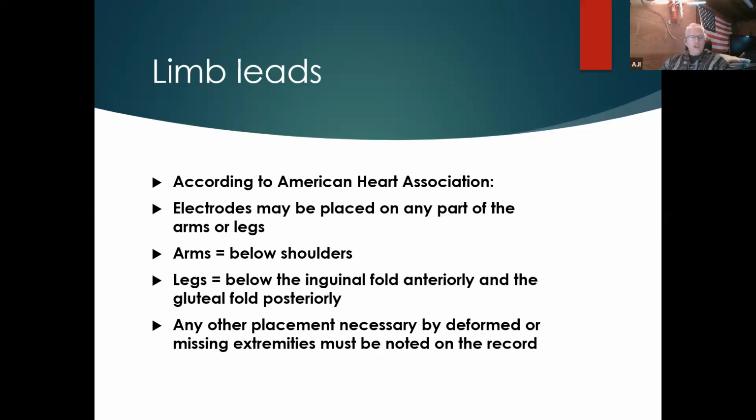It doesn't matter where you are. People are going to wear long pants. People are going to wear long shirts. This is what they do. One of the things we're limited to, we should try to expose skin, but we don't want to potentially do that and make the patients uncomfortable and cold. We don't want them to lose body heat also when they're doing that. So keep that in mind while we're doing this.